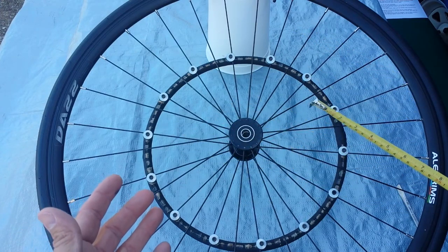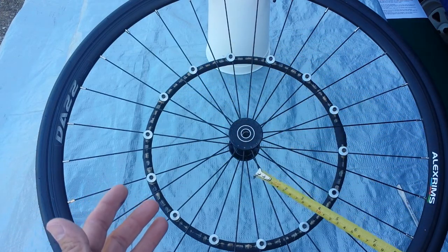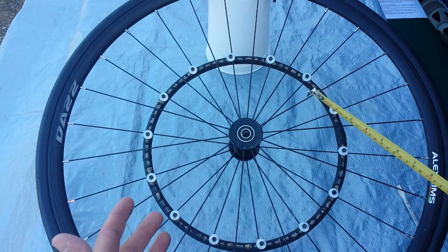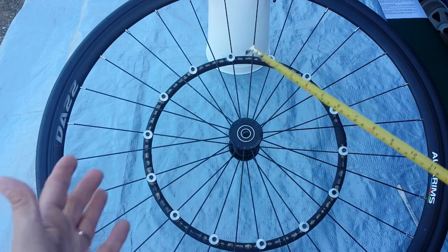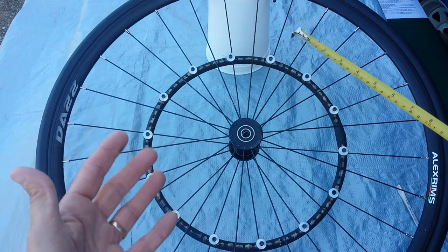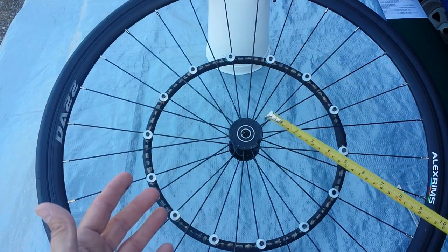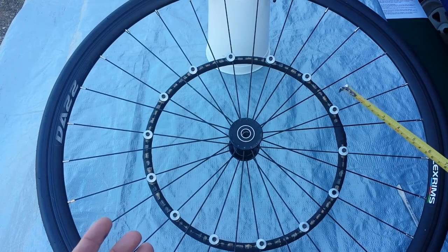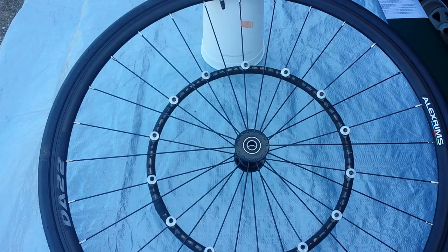Once the spokes are all fit in place, start tightening it up, making sure that the hand rim is fairly centered on the wheel. You don't want the hand rim wobbling — you want it centered toward the hub. Tighten everything up, get it good and snug, and you're ready to go.